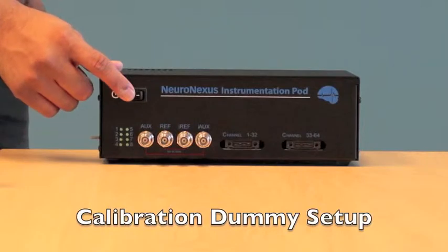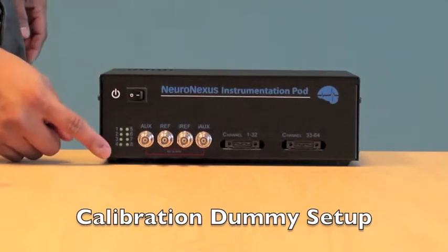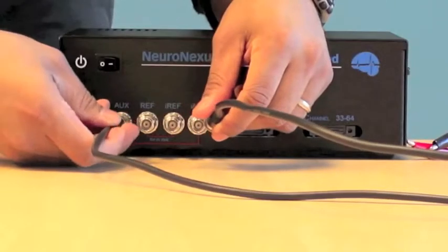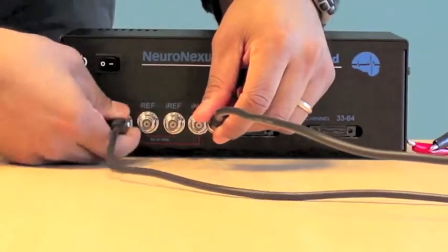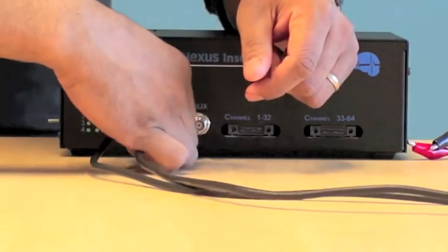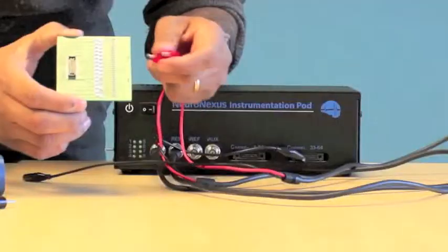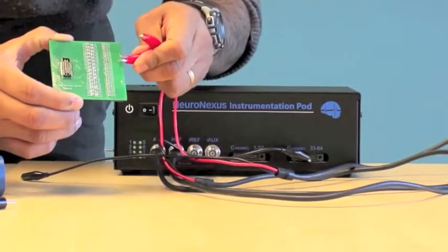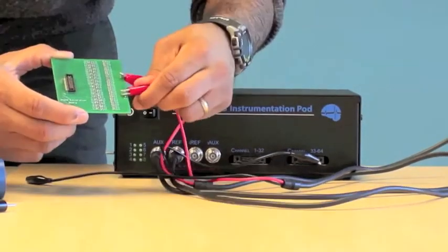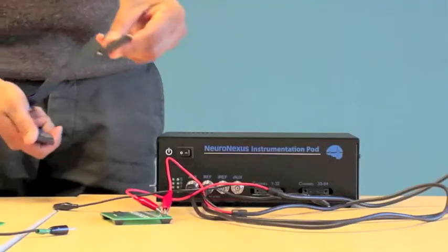Turn the power on and make sure the lights are illuminated. Take the black BNC to alligator cords and plug them into the AUX and REF inputs on the front panel. Then take the red pins and pin them to the AUX and REF pins on the dummy.